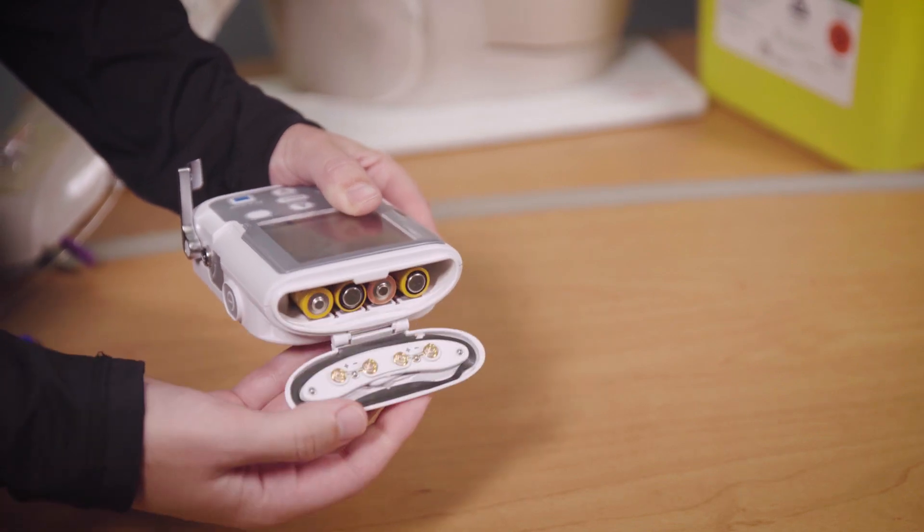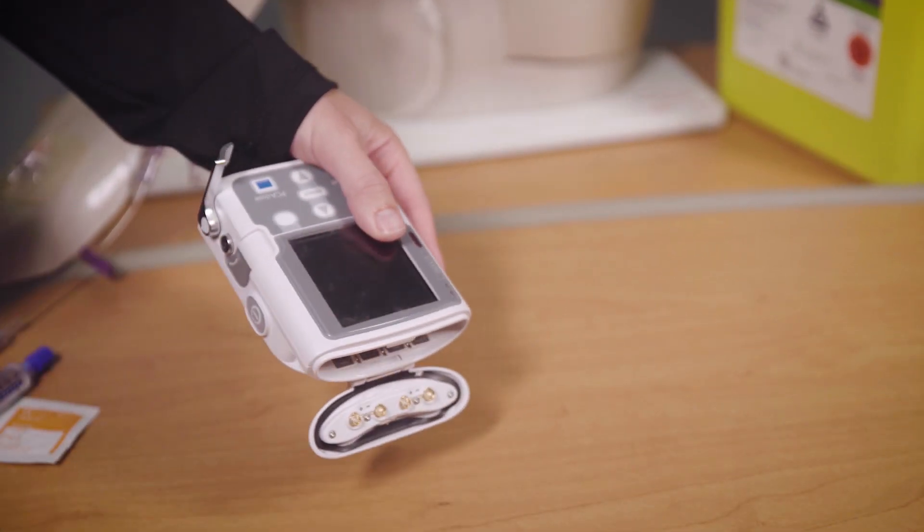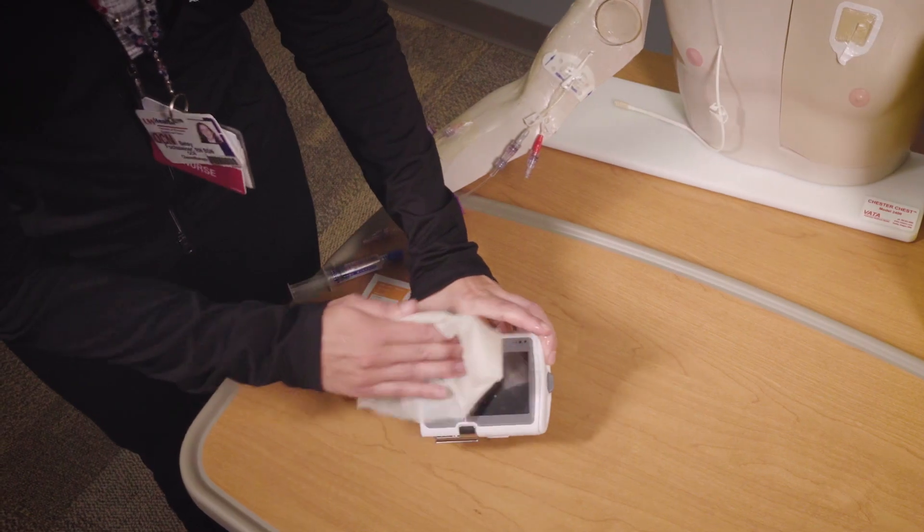Remove the batteries from the infusion pump and discard them. If you think your infusion pump got any chemotherapy on it, wipe it off with a damp soapy cloth. Wash your hands using soap and water, not just alcohol gel.